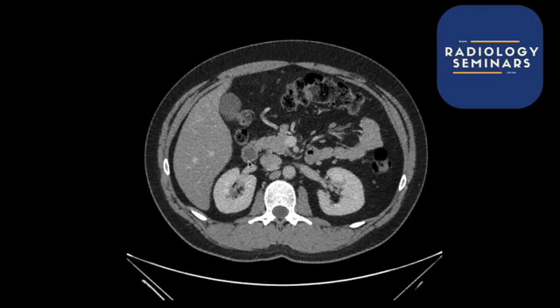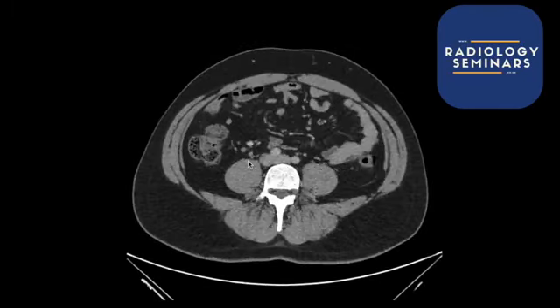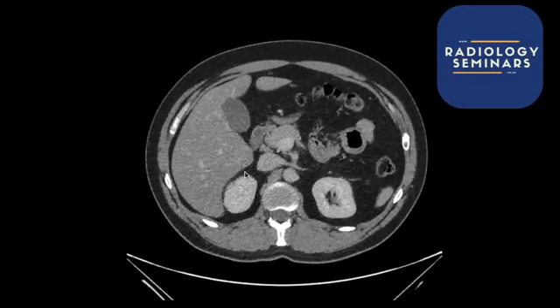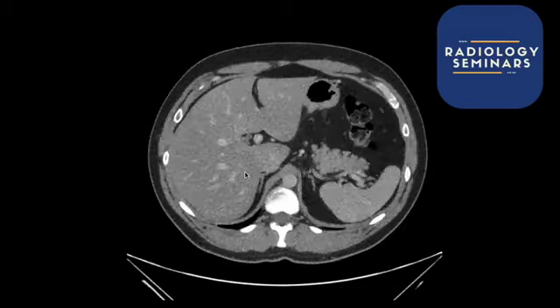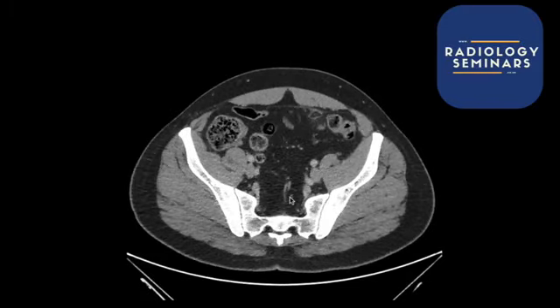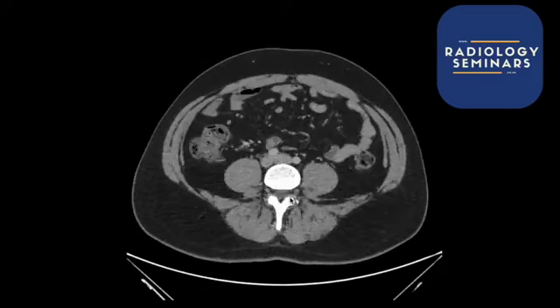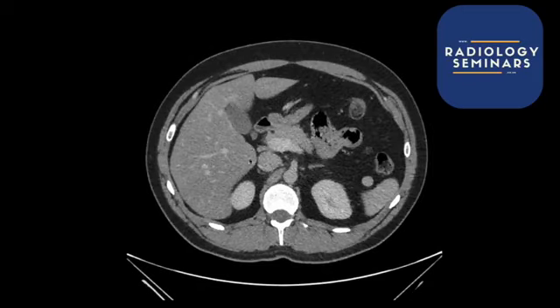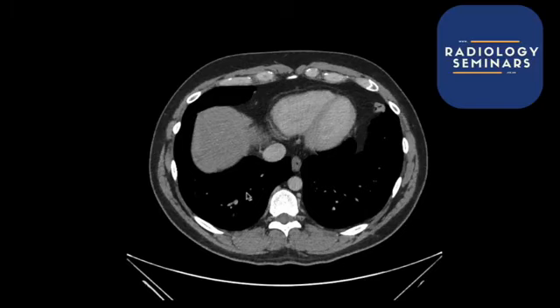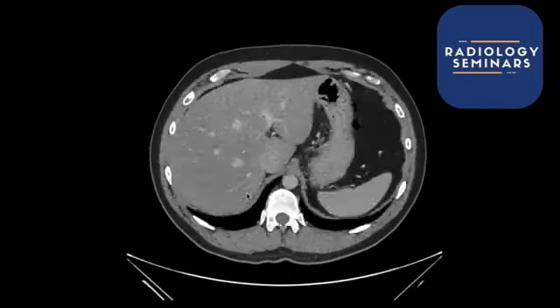But in the meantime, they could have a raging obstruction, a really bad obstruction, and you're faffing about looking at what liver lesions are and what imaging to use to find out what particular kind of lesion this could be. Or, even worse, they could have a big intra-abdominal bleed, and they're in a really bad shape, and you've got stuck right at the top, still looking at this particular lesion. So my first big piece of advice is, when you've got a scan, go all the way from the top to the bottom.